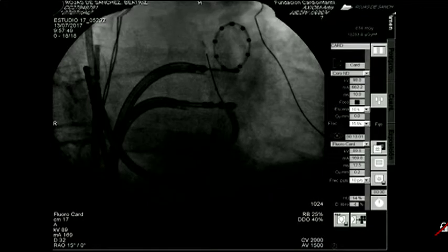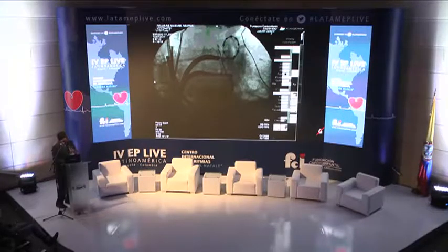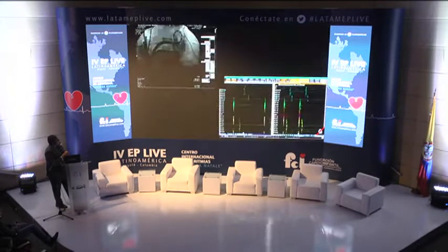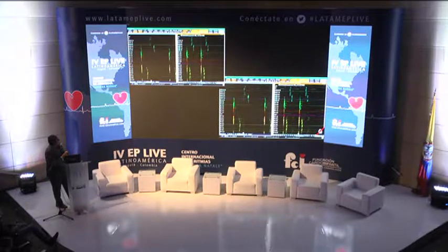Chief, wait a second. Yes. This is an important point. Last thing. Look at the pacing signals. We're pacing from distal CS. Can you guys switch to the fluoro here, please? Ponlo en vivo las imágenes. Beautiful. Es conexión de la vena de Marshall. Pongan los electrogramas en vivo, por favor. Now we are seeing EGMs, en pantalla grande, los electrogramas en vivo.